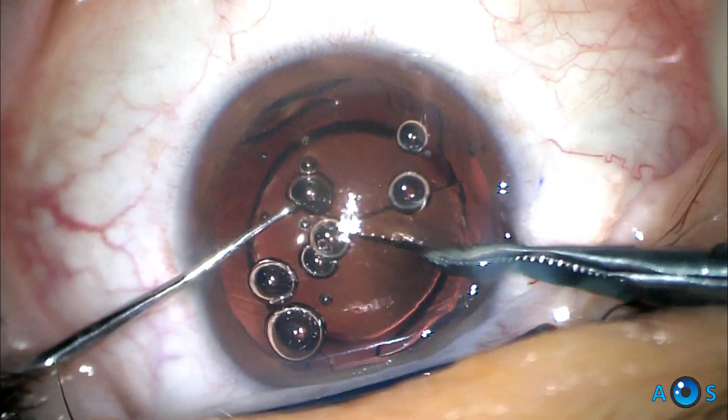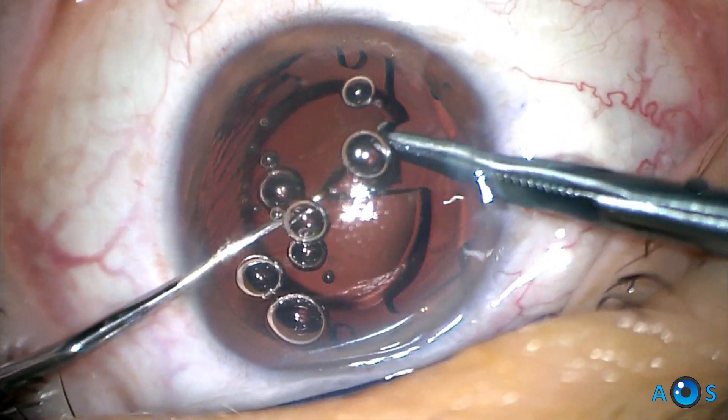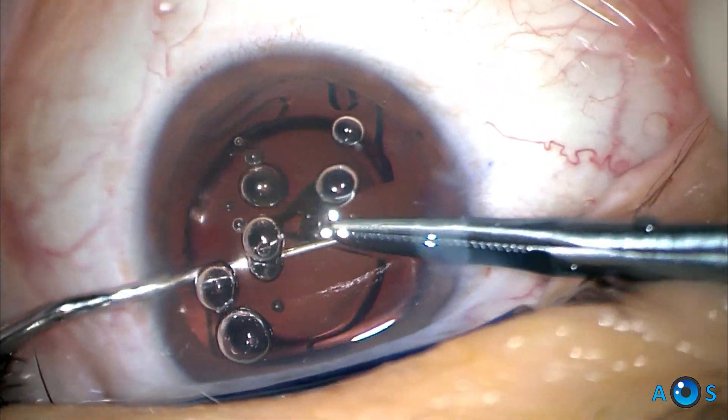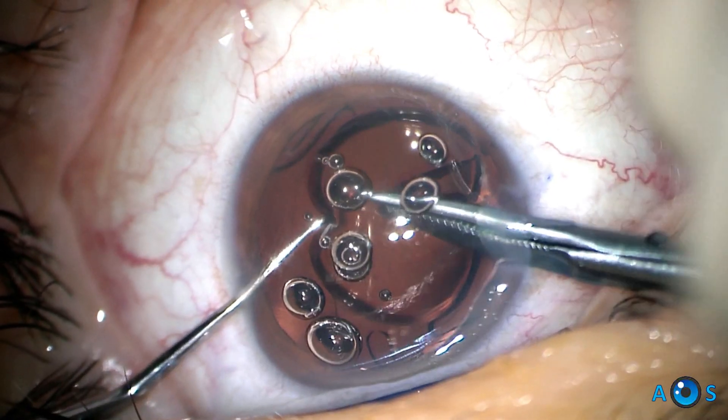A second cut is complete, and now we have a slice on the IOL optic which we need to remove. This can be done by careful controlled mechanical traction on this area, and if required, a third cut can be done on the apex of this IOL slice to complete the section and release the segment.